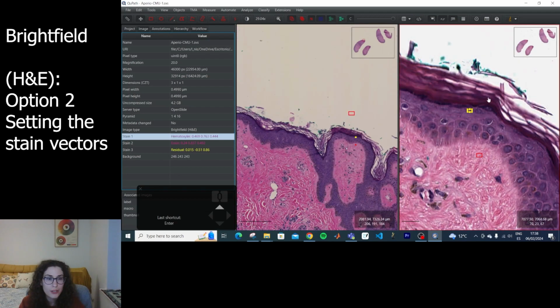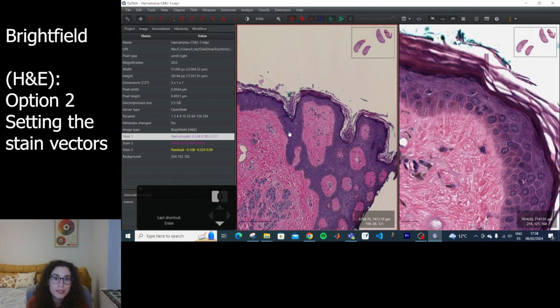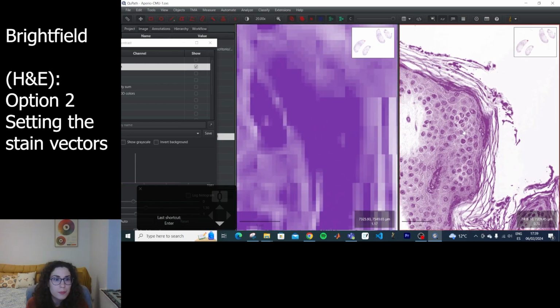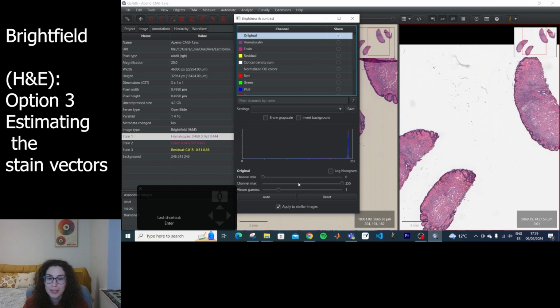And now, I don't want these annotations anymore. Can I just delete them and be okay? Yeah, okay, so you can delete them and it's fine. Good. I want to see the difference when I do this. Are the values now more similar to each other? Still not the same. And this, ladies and gentlemen, is why ICC profiles are a problem that I hope someone wants to resolve at some point. I bet you, Hamamatsu, please just help us deal with this.